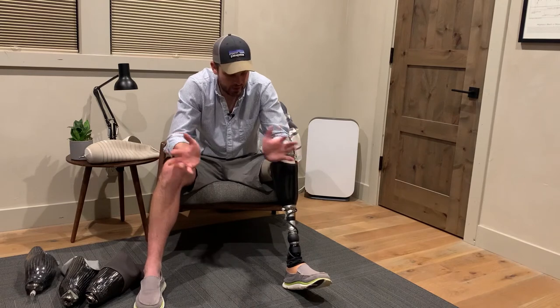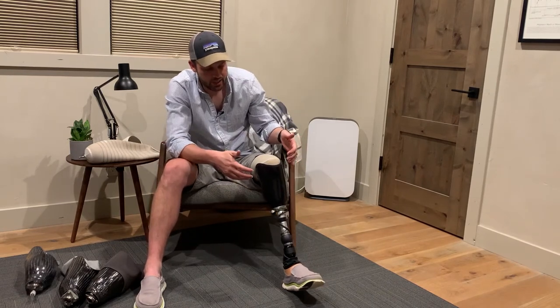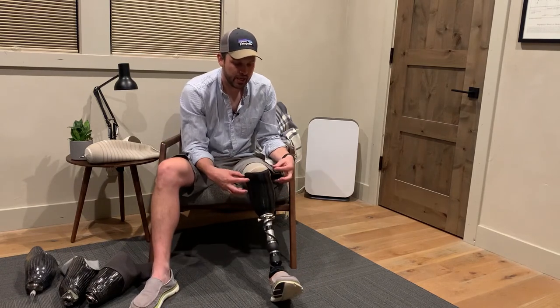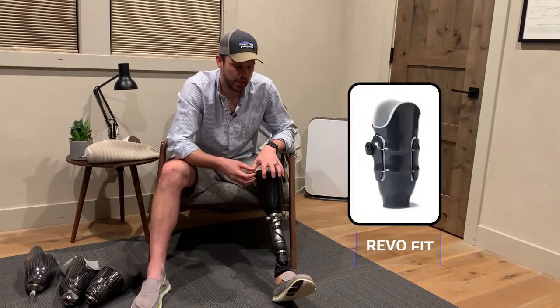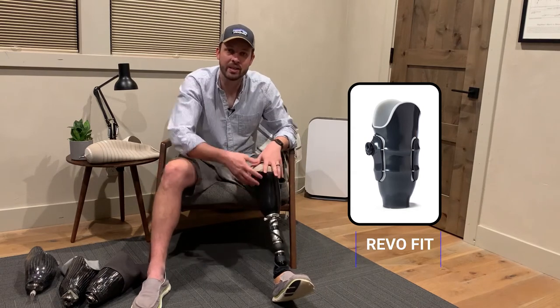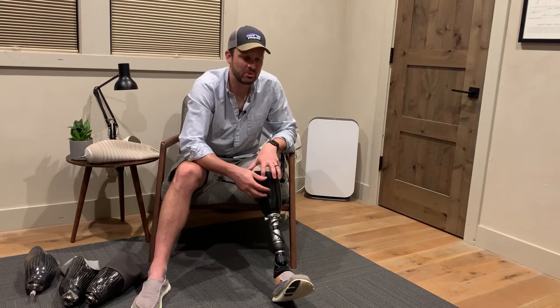An option between a hard carbon socket and a soft socket is one where they cut away portions of the carbon fiber socket and use a BOA system, like you might see on a snowboard boot. You just dial it in and can loosen or tighten it depending on what you're doing or if you have pain in a certain spot on your leg, which gives you some flexibility.